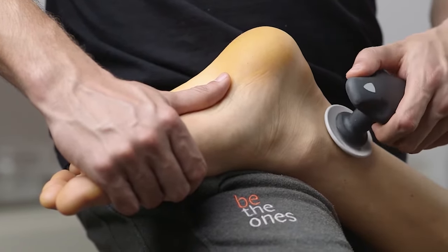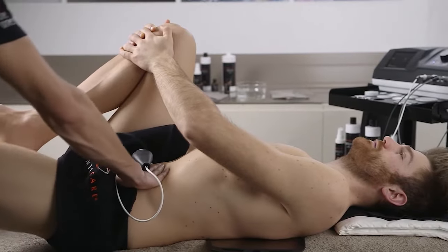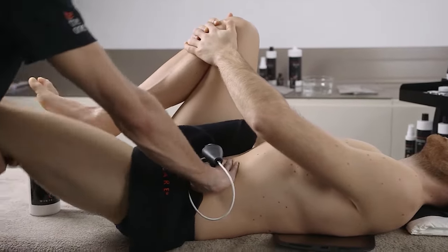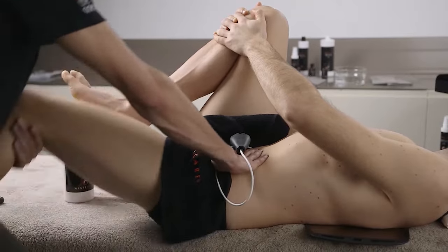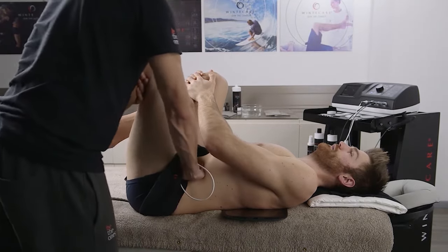The precision with which the device delivers the energy makes it ideal even in case of acute inflammation, where it is important to keep the temperature of the tissues below 38 degrees centigrade.